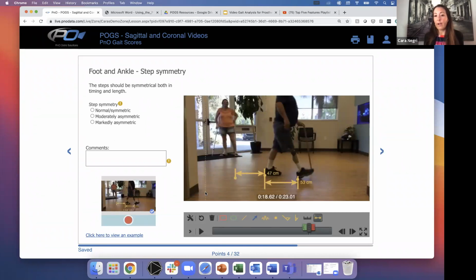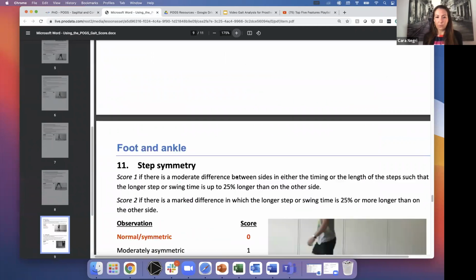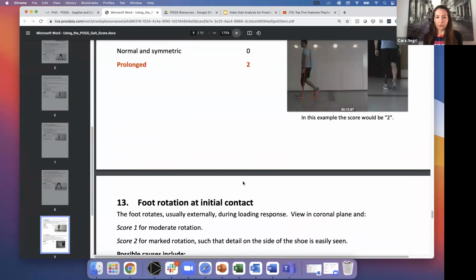He feels like he's going to fall out. So he doesn't have any stabilization at the hip, so he's trying to get off of it as quickly as possible. And that's stuff that I can put into these notes as well, so that I can send over to the doctor.